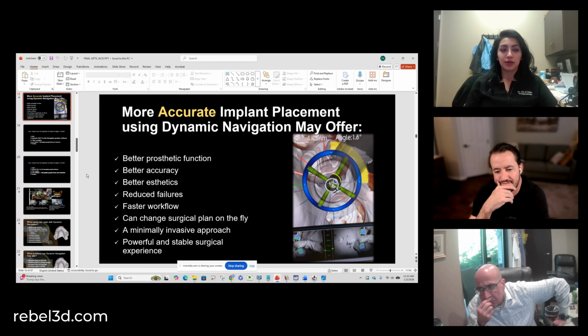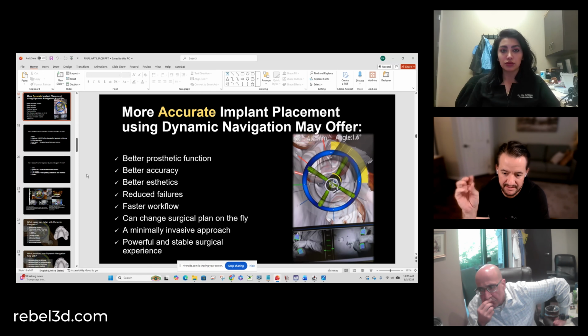So to us, that's the most important thing. The patient is able to occlude perfectly. You can appreciate the result that you had planned. So you're typically delivering their first provisional 24 hours after surgery, the next day. I've actually heard more and more doctors doing that.